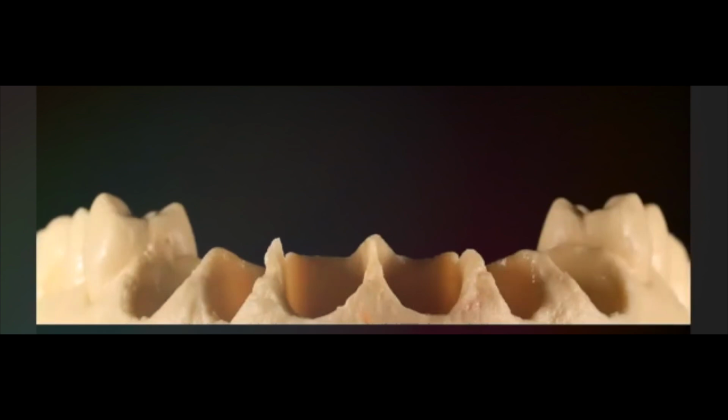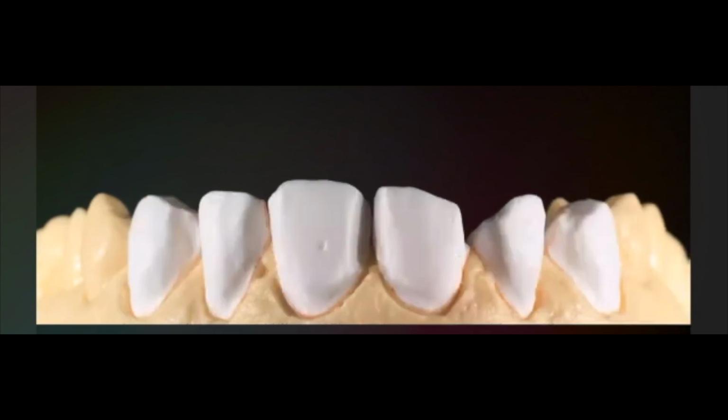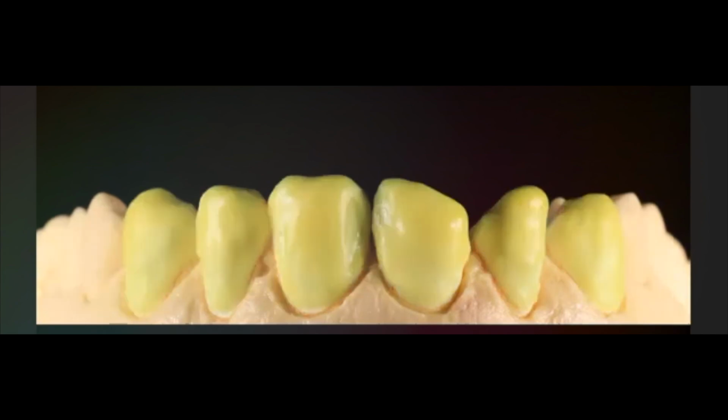This is the alveolar model. The refractories with the preparations. And first we do the foundation, the wash bake, in order to have a good connection of the ceramic with the refractory material and to avoid bubbles and some air between ceramic and refractory.